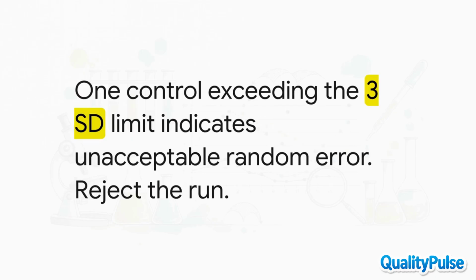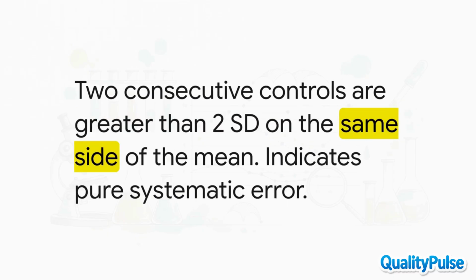Now the 1-3s rule, that is a hard stop. This pattern happens when one single control observation exceeds the plus or minus 3 SD limit. This indicates either a completely unacceptable random error or the dramatic beginning of a massive systematic error. When you see this, you must reject the run immediately and halt all patient results. No exceptions.